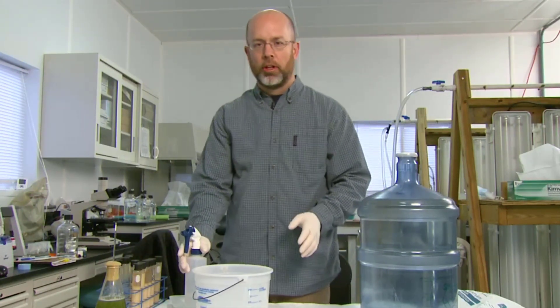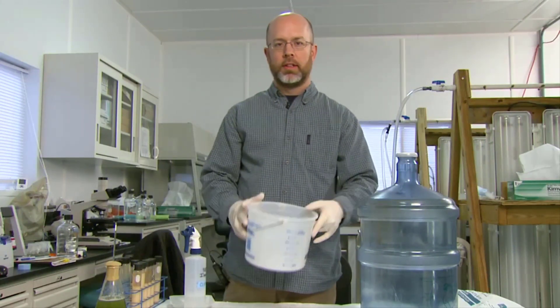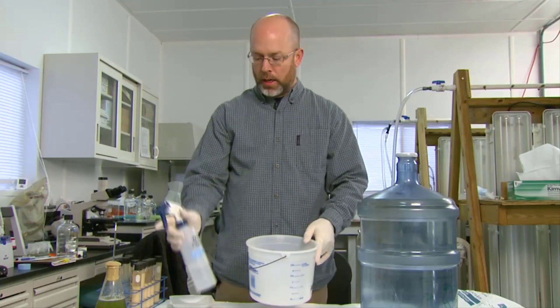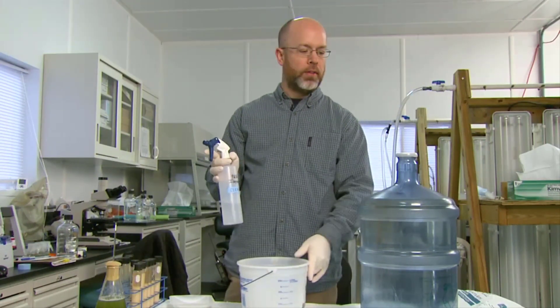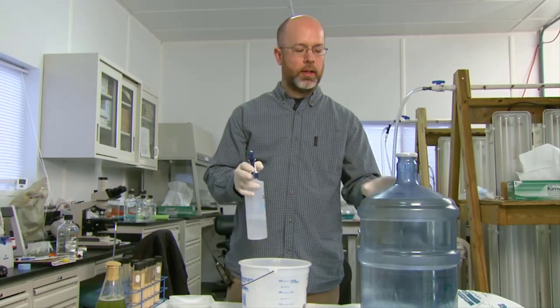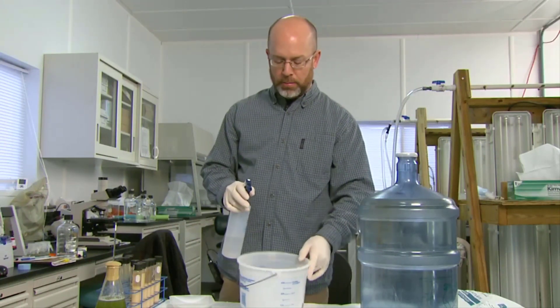This might seem like a little bit of overkill, but I recommend that you sterilize this container as well, even though you're not going to be putting any algae in here. This will save you some labor time down the road. If this culture crashes, you have to go through the whole sterilization process again, re-inoculation, and wait two weeks for it to grow. Just do everything right the first time and you're good.